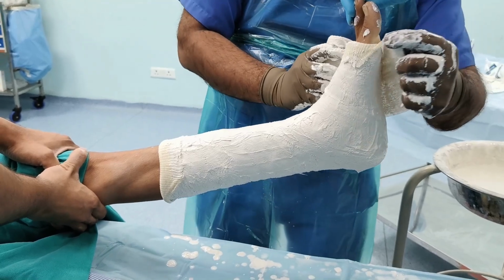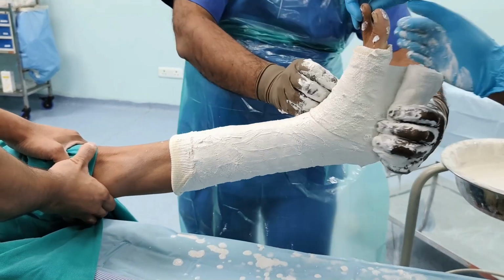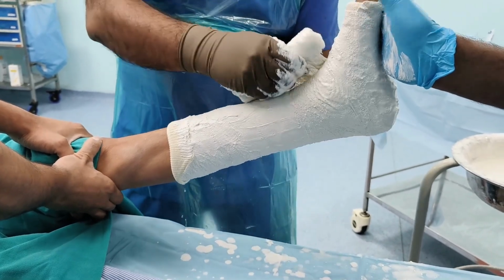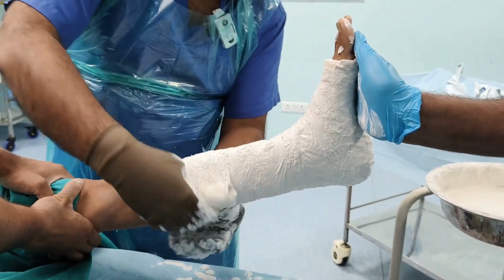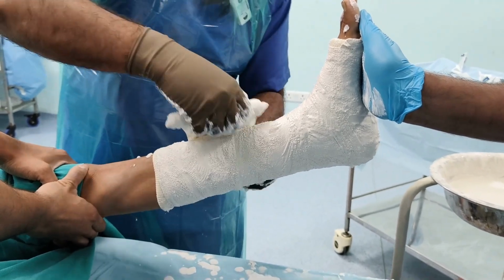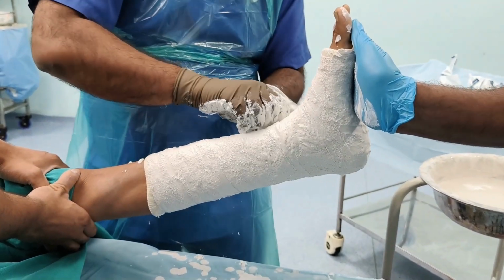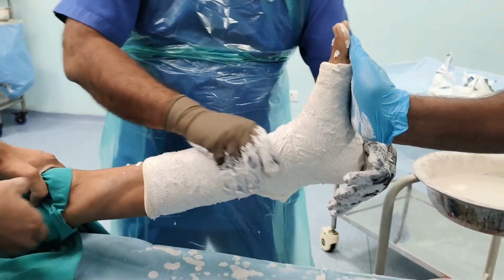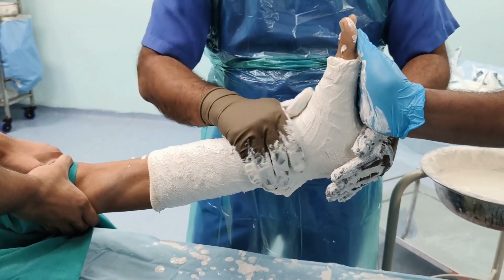So while applying this, I have to cover the margin of the stockinette which I have rolled back and do the final molding so that I attain the desired position and desired shape of the plaster which I need. So finally I just smoothen it out.